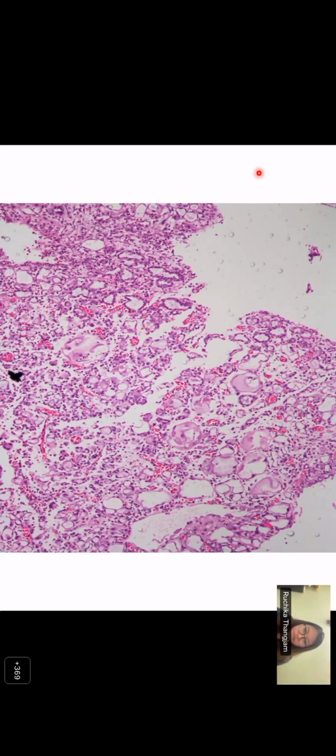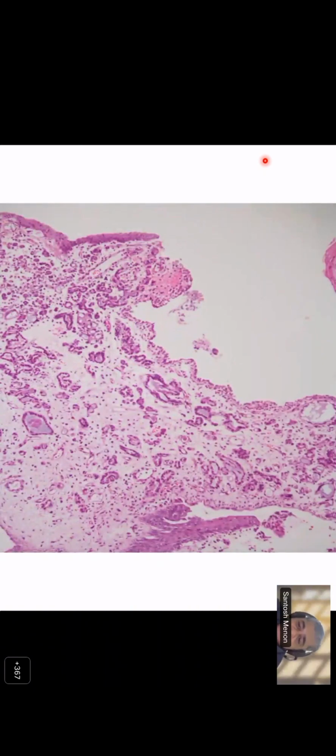Verma sir, are they on the right track of thought? Yes, they are getting there. Obviously, there are a few more points which need to come out. They have found out that they look signet, and they do think that there is some mucinous material. Definitely in this tubule there is some mucinous material. And some of these things look like capillaries, and then there are very small, probably single looking cells, but then there are definitely these tubules with this myxoid mucinous kind of material.